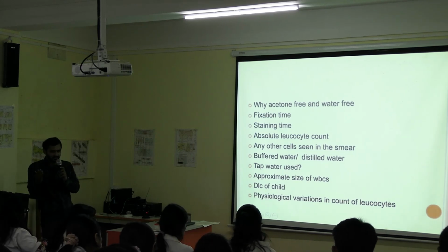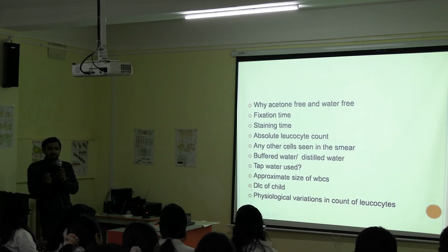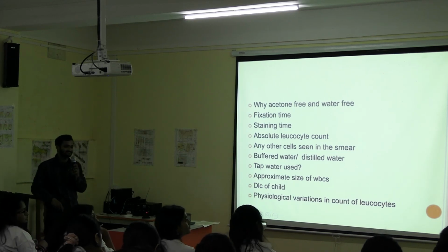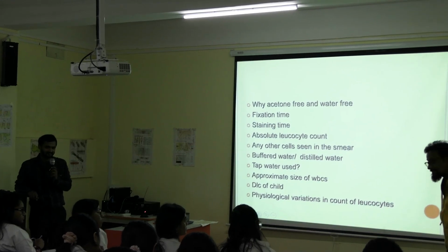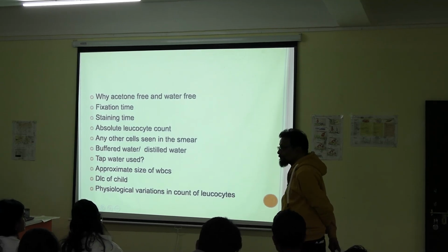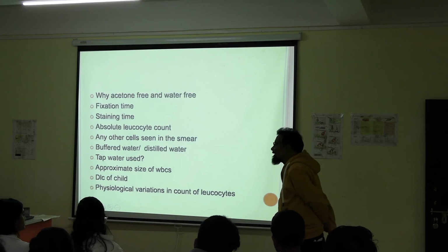Name any disease condition where we see something under a peripheral smear, under a microscope, and what do we see? Any condition? We told you in the buffy coat, other than WBC and platelets, some abnormal cells may remain there. So if we do a smear, these cells may remain here.